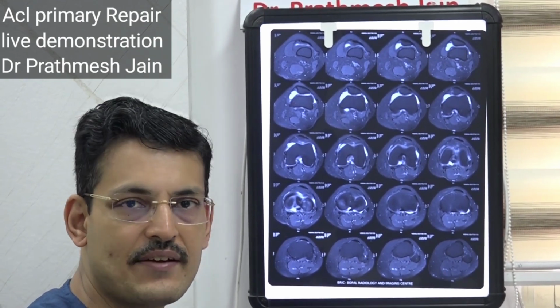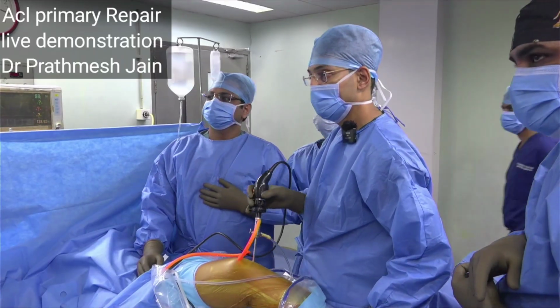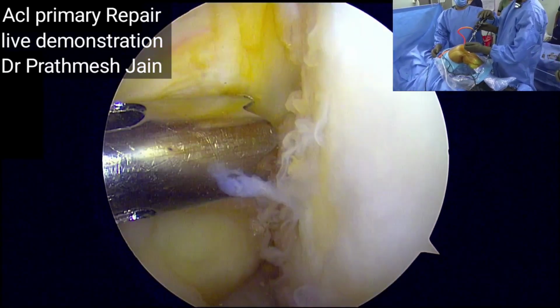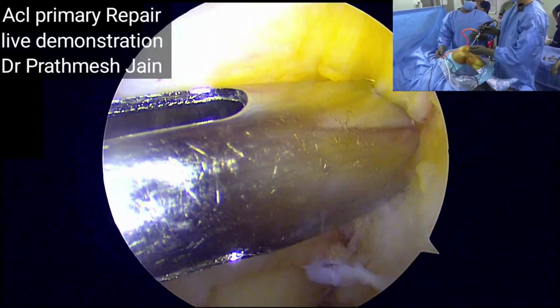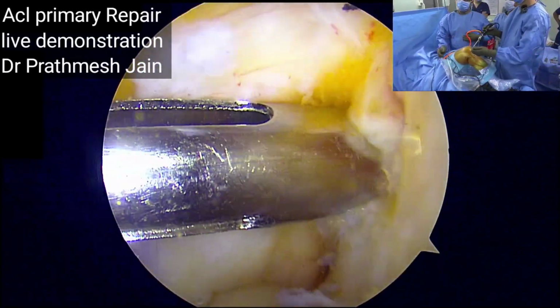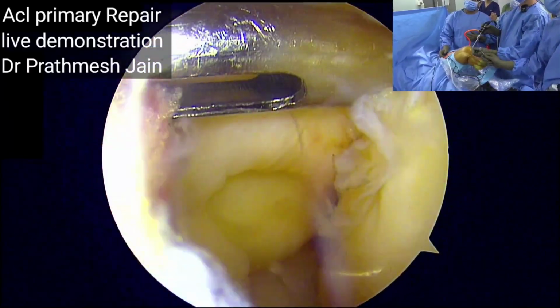So let's start the live surgery. Good morning everybody. We have started the diagnostic examination, and it's a very good technique to repair the ACL primarily with this technique. So just do a gentle tap with the hammer, please. Okay, go ahead. Very good.